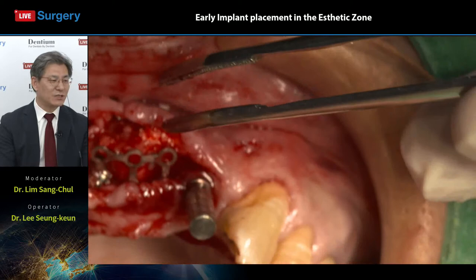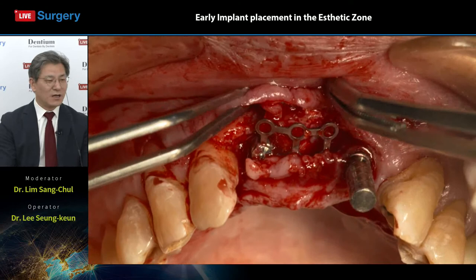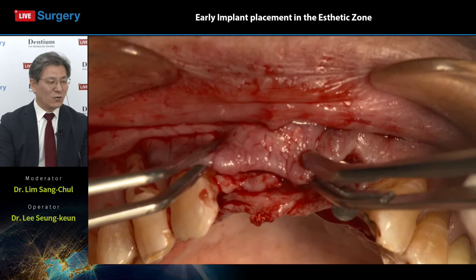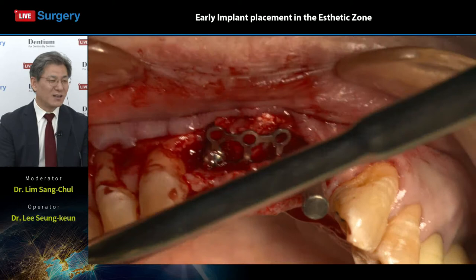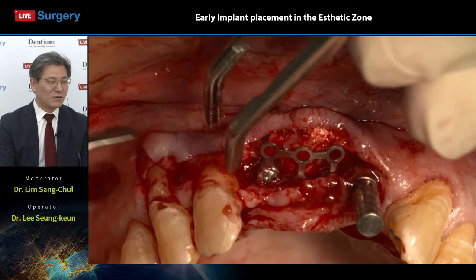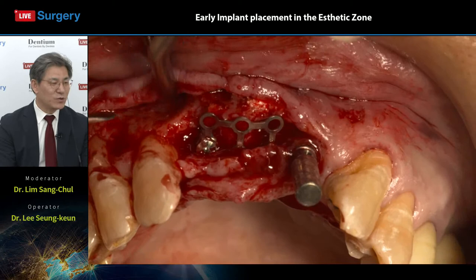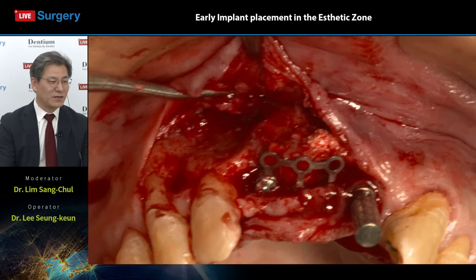Check that there is no soft tissue penetration, right? With a wrong position of the scalpel, the manipulation can cause soft tissue perforation. That is not a good situation for covering the underlying graft materials, as you know. So to avoid this soft tissue penetration, you have to use this 15 scalpel, very gentle and slightly. Any question?